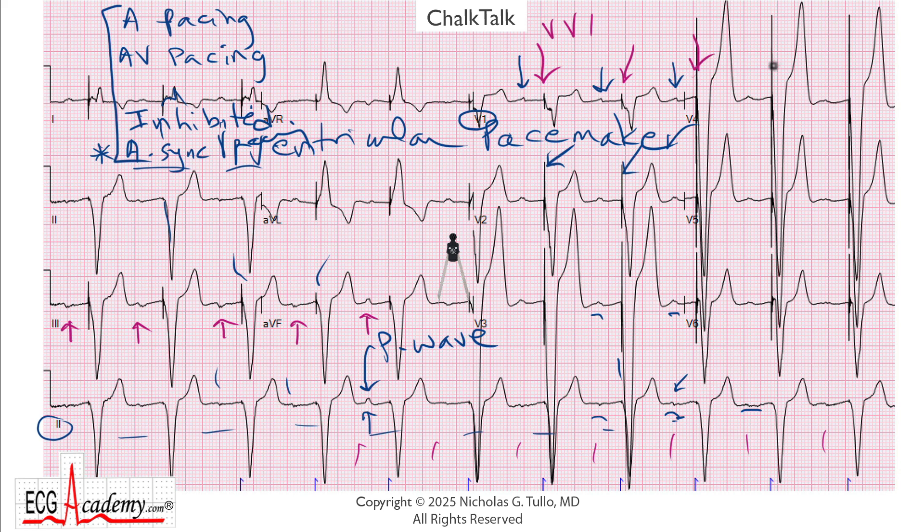If that was the case, then the ventricular pacing spikes should be absolutely perfectly regular, because after all, pacemakers are like a clock, and so you should see absolutely no variation in the spike-to-spike interval. So let's take our calipers again and see if that's the case — we'll put the calipers on two spikes in a row and move them over to see if the spikes are perfectly regular. Well, look at that — that one comes a little bit later, that one comes on time, this one comes on time, but that one's clearly later. So the spike-to-spike interval is not constant; you have variability in the spike-to-spike interval. And that variability tells you that the pacemaker is being triggered off of these P waves, so you've essentially proven that this is a dual chamber pacemaker, DDD, and it seems to be tracking the P waves.